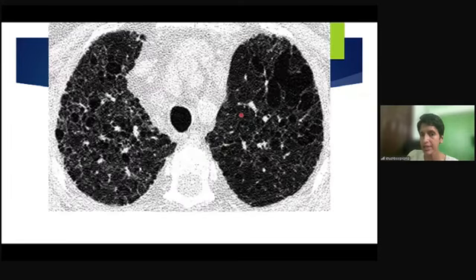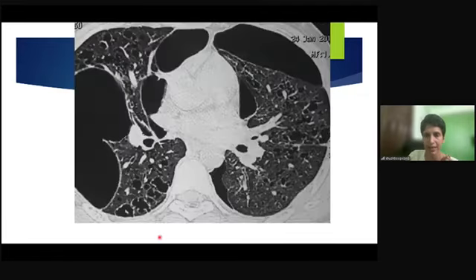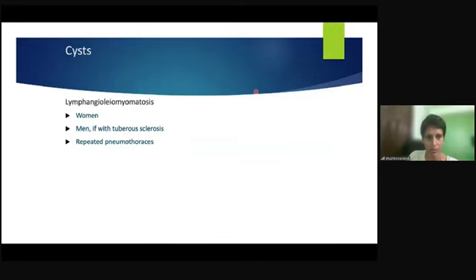So when you see such cystic areas all over the lungs with some background nodularity in a smoker with an upper lobe predominance, you know you are dealing with pulmonary Langerhans cell histiocytosis. You see this typical upper lobe distribution and the costophrenic angle sparing in these cases. Often these cysts can also be larger, leading to pneumothoraces, where you see these loculated pneumothoraces. So this is a pulmonary Langerhans cell histiocytosis cyst in a smoker with upper lobe distribution.